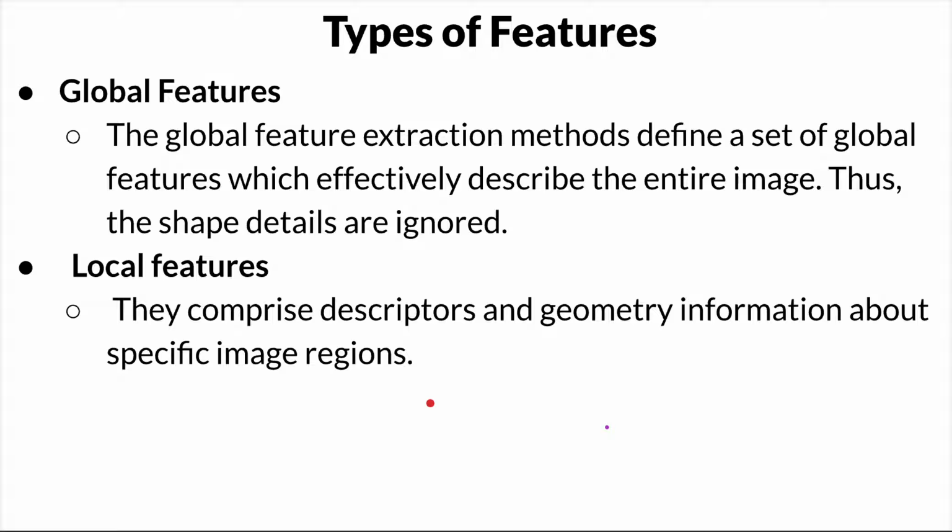But if I'm coming to the SAS building, that is a local feature, because here I'm paying attention to a specific thing. So for global features, you're just looking at the image. When the radiologists try to read the scan, first they look at it globally before they pay attention to it, because the global features also say a lot.